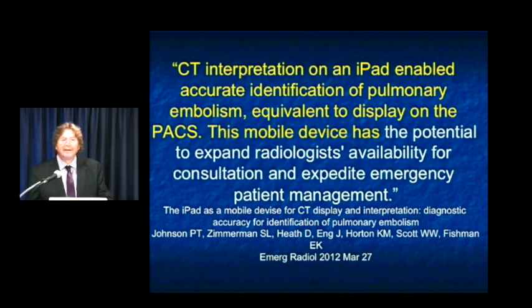So now you have the information everywhere, and it's not just for the radiologists, it's for the referring docs. They can see their information wherever they are, in their office, in their car. They can, hopefully not while they're driving, of course, look at the information with the patient at the bedside. It becomes a very strong patient education tool.